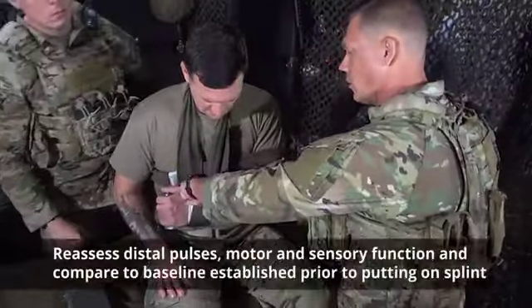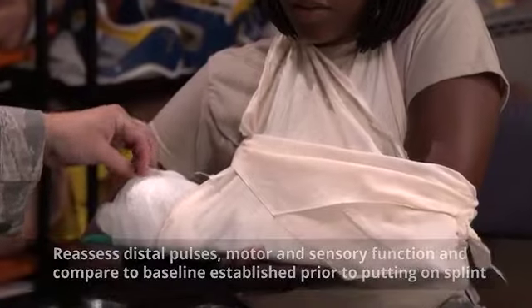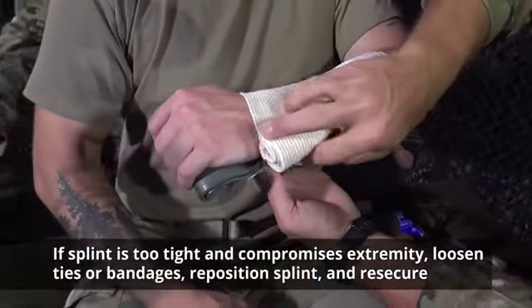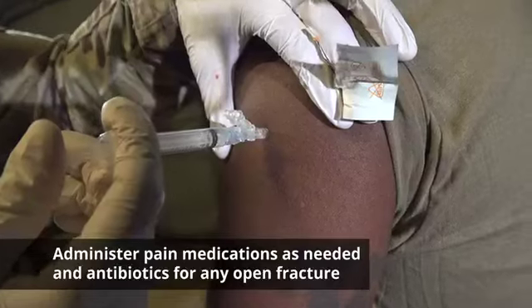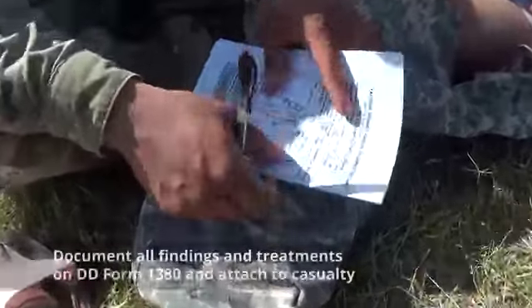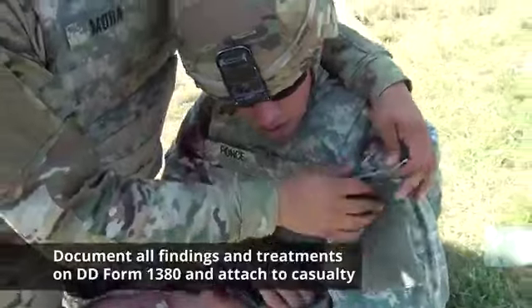Once the splint is applied, reassess the distal pulses, motor and sensory function, and compare it to the baseline you established prior to putting on the splint. If the splint is too tight and compromises the extremity, loosen the ties or bandages, reposition the splint, and then re-secure it. Administer pain medications as needed and antibiotics for any open fracture. And as always, document all findings and treatments on a DD Form 1380 TC3 casualty card and attach it to the casualty.